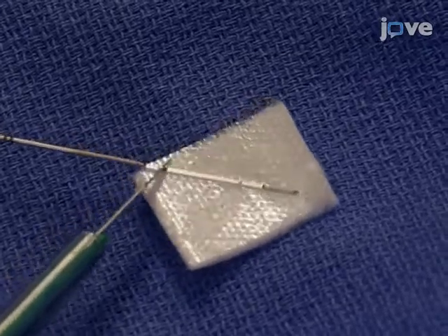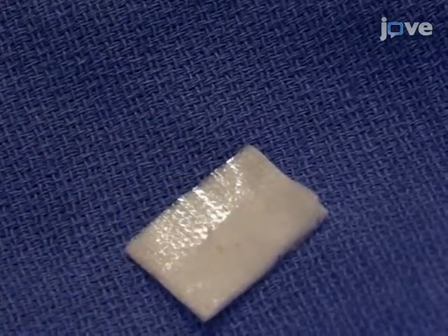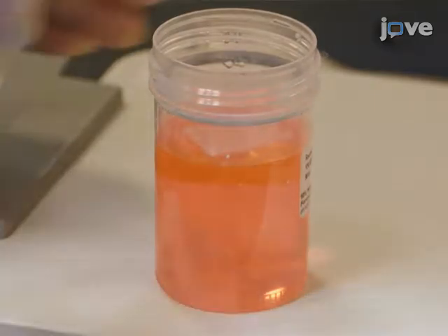Pathological evaluation of the samples obtained by EBUS-TBNA and eTTNA includes cytological and histological assessment, including a modified Romanowski stain that allows adequacy evaluation and cytomorphological diagnostic of the pathological specimens.